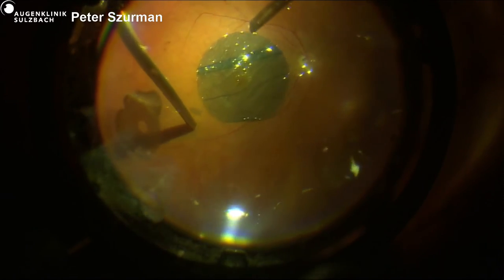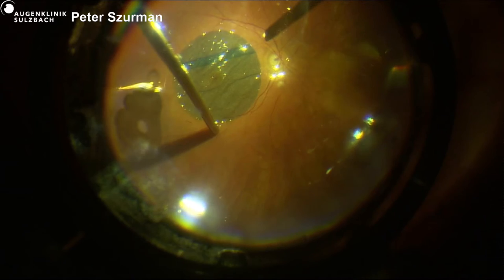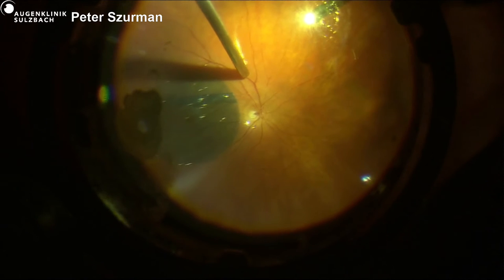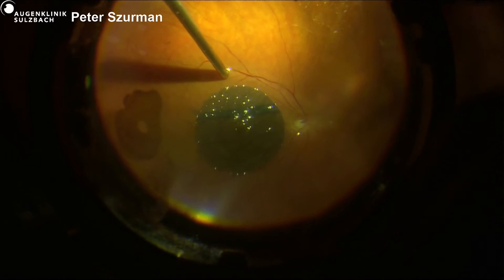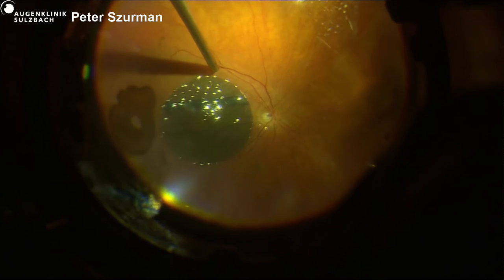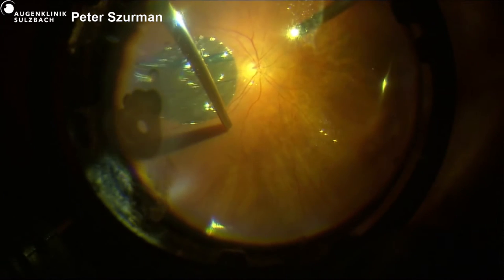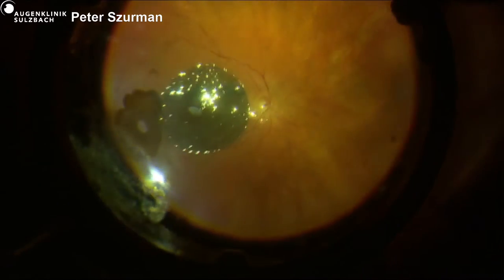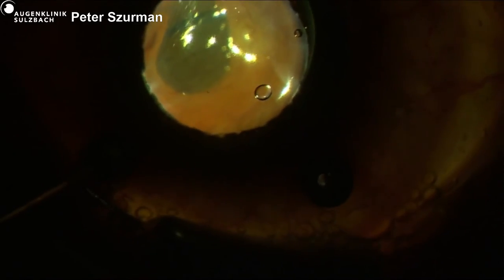The patient is a young lady with a visual acuity of counting fingers. She had already undergone previous vitreoretinal surgery, and as you can see, they tried to treat a bit even with lasers. The recurrent retinal detachment that she has today, we speculate, has a mixed pathogenesis, due both to the pit and to the hole in the macula. The retina looks stiff and wrinkled, and there is still a residual bubble of gas that you can see in the wide-field retinography. So we are all looking forward to see how Tommaso is going to handle this highly challenging case.